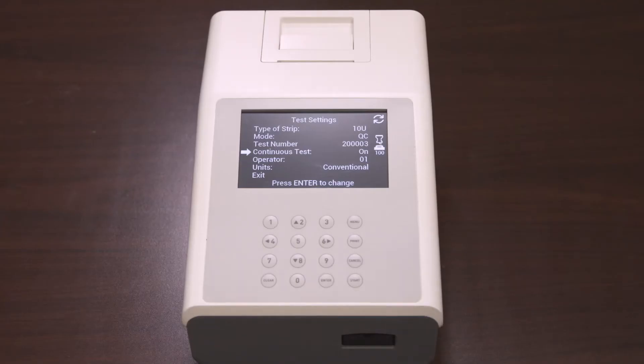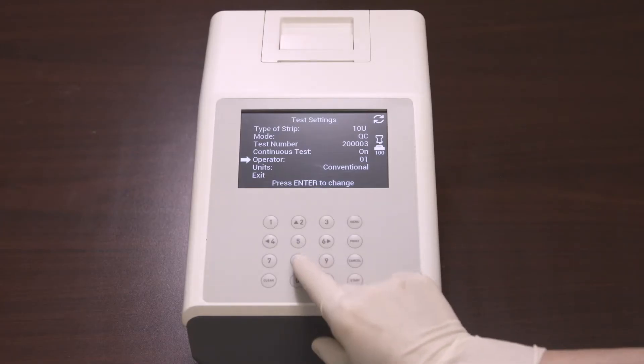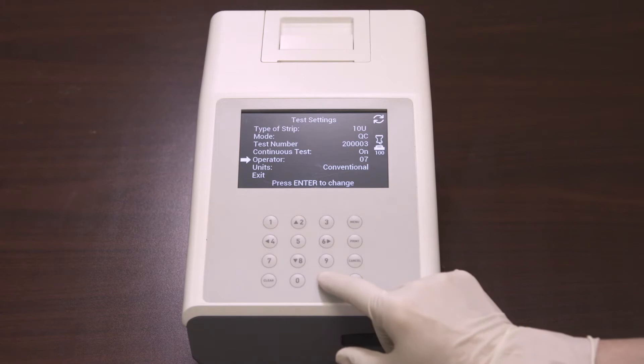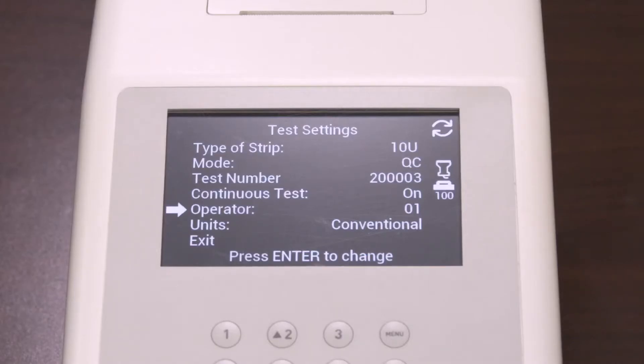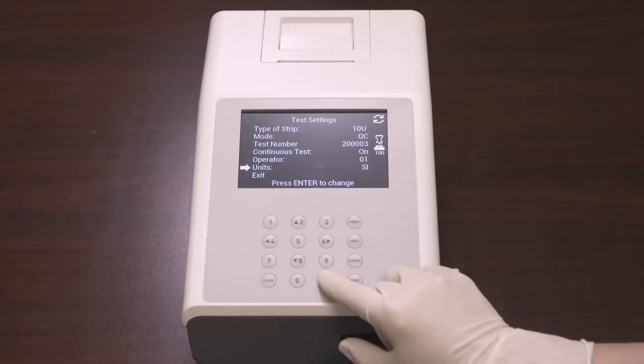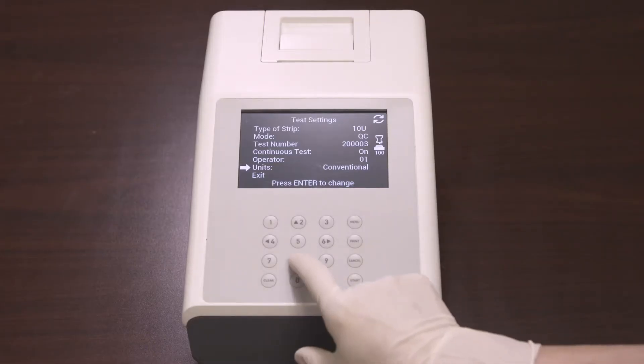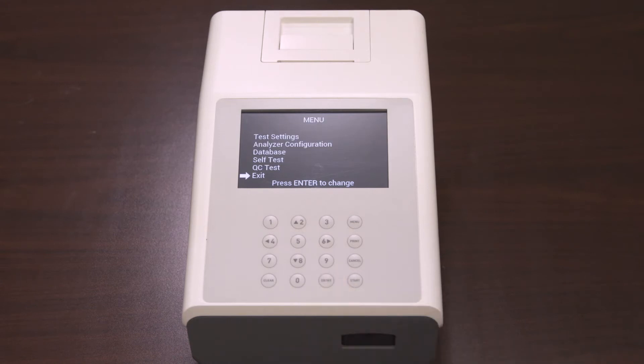Next is operator. Select operator ID and press Enter to increase the number by 1. After the number reaches 10, it will revert back to 01. The last option in the test settings is units. Select the units and press Enter to cycle between conventional or SI units. Once you finish all your selections for the test settings, select Exit and press Enter to return to the main menu.